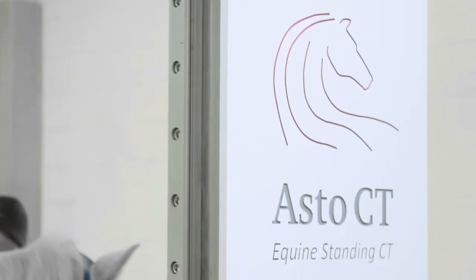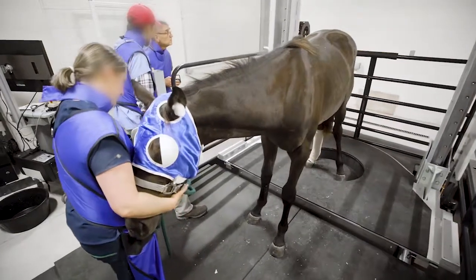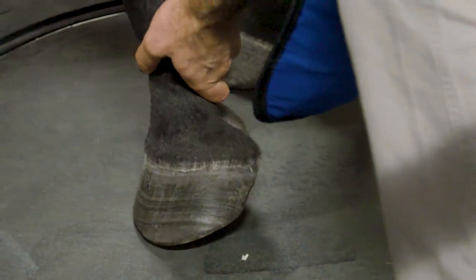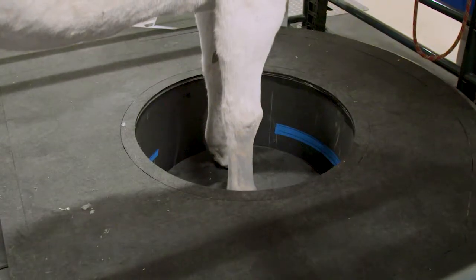It has rotation speeds of once per second, giving you 36 slices per second, and the fan beam CT that's on board allows accurate reconstructions even if there's slight motion of the horse, like swaying as it's sleeping and standing up.